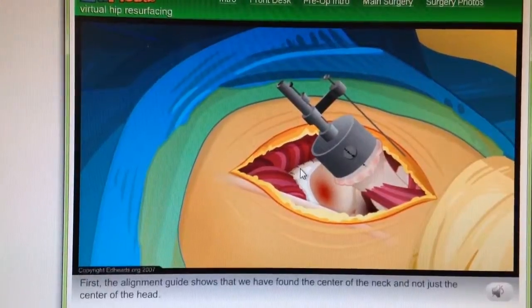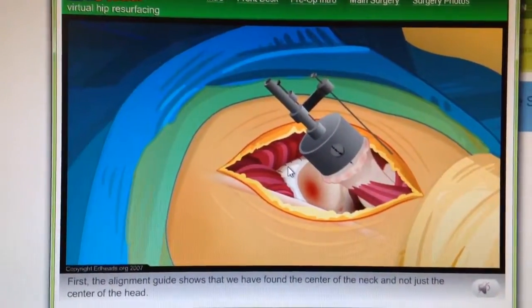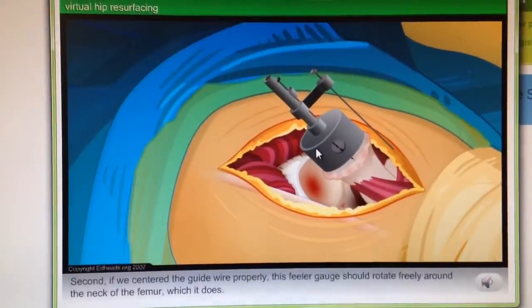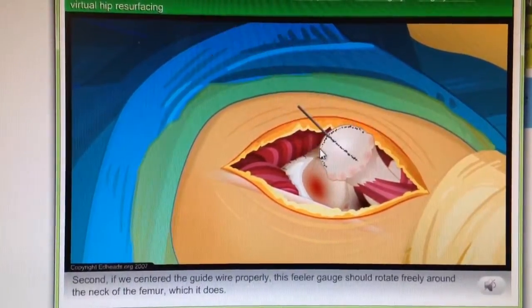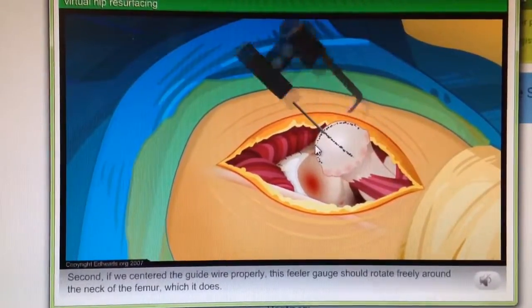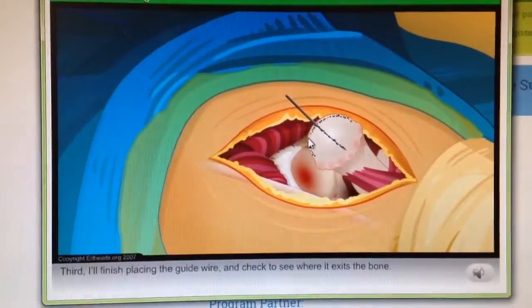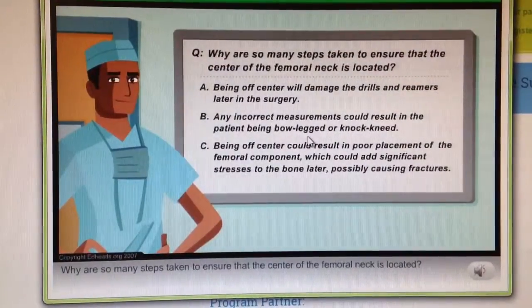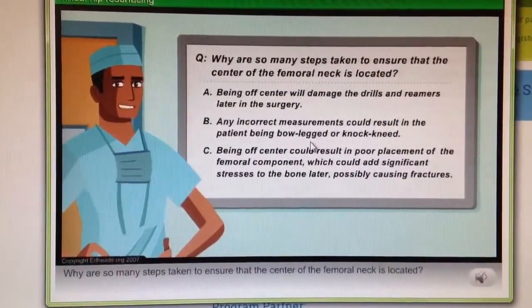First, the alignment guide shows that we have found the center of the neck and not just the center of the head. Second, if we centered the guide wire properly, this feeler gauge should rotate freely around the neck of the femur, which it does. Third, I'll finish placing the guide wire and check to see where it exits the bone. Why are so many steps taken to ensure that the center of the femoral neck is located?